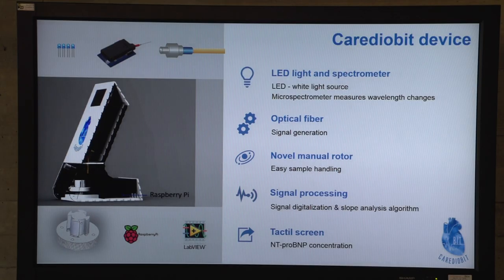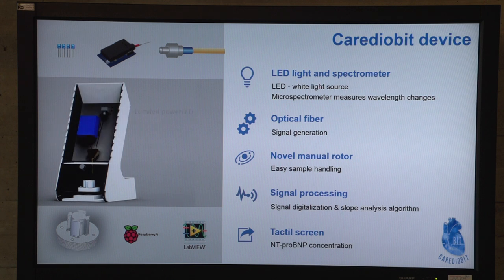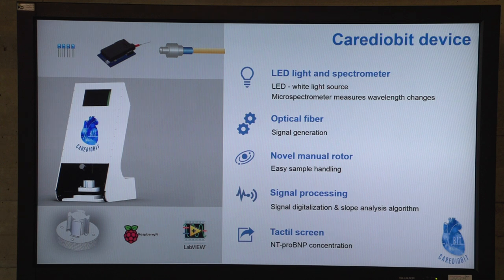Now to see how our sensor is built: since the technique is based on the detection of a shift in wavelength, we need a light source and something for detection. As the light source, we use an LED fitted in a special holder, and we use a micro-spectrophotometer to detect the shift. We then connect those two components through a bifurcated fiber to our functionalized fiber with the antibodies.